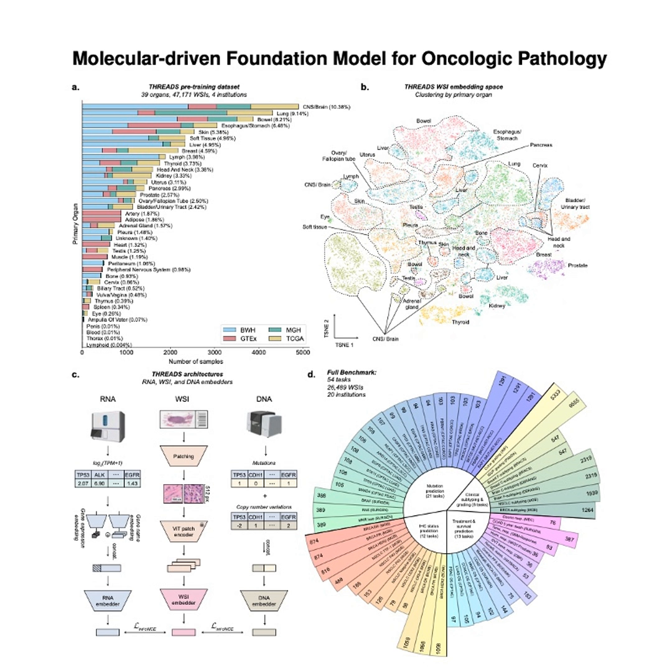You got it. And the magic, again, is that the training process is constantly forcing the visual features learned by the image encoder to align with the features learned by these 2 separate molecular encoders. That's the cross-modal learning again, yes. Constantly making sure the visual representation matches the combined molecular reality. It's definitely a complex bit of engineering, tailored for these very different but linked data types.